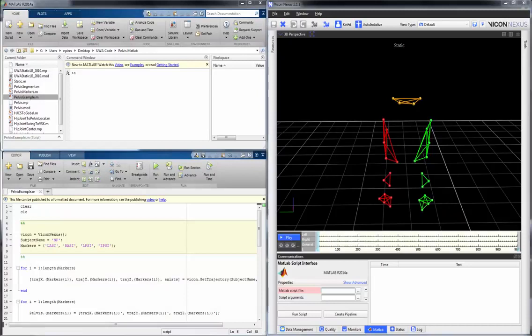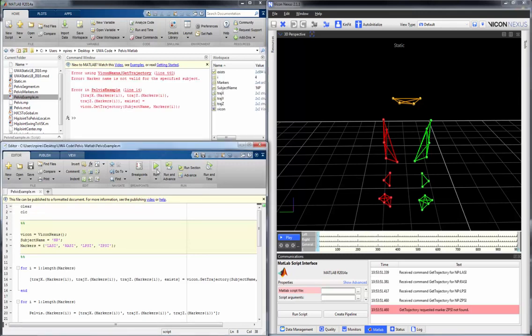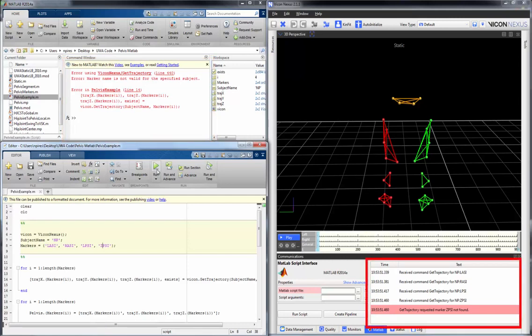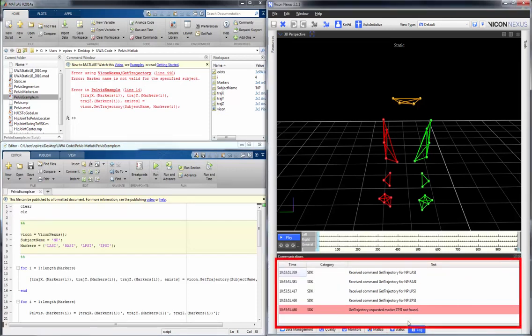Another great feature of the Nexus 2 MATLAB interface is the ability to debug. In this case, I intentionally mislabeled a marker in my script. No matter how you execute the script — through MATLAB or Nexus — you will get the error messages through both MATLAB and the Nexus MATLAB log and the general communications log. We can see here that the marker name was misspelled, which is the error.